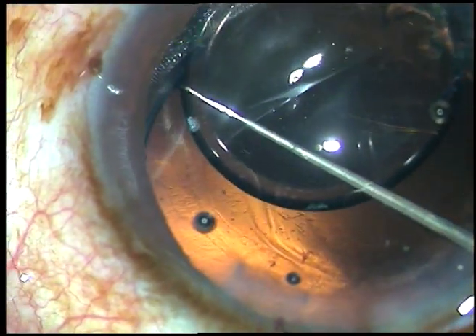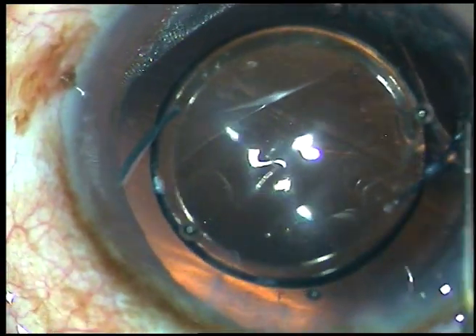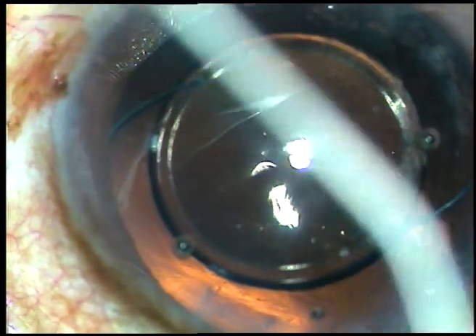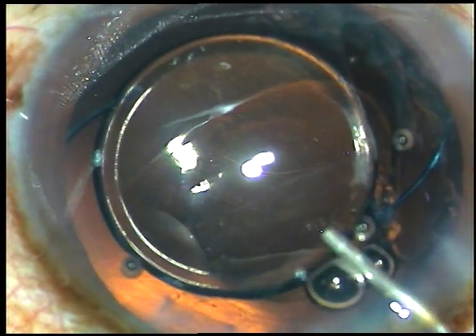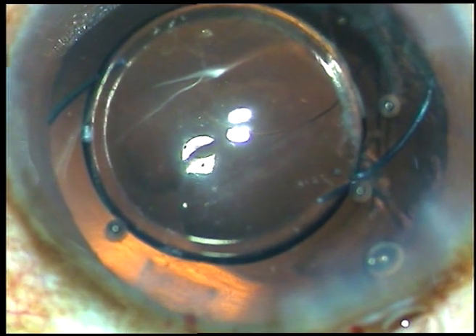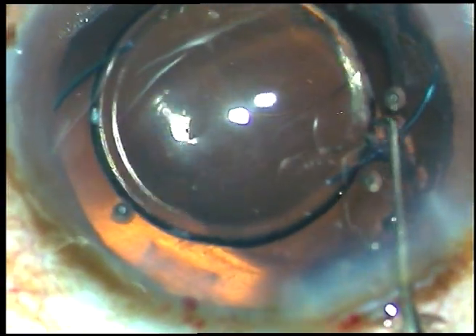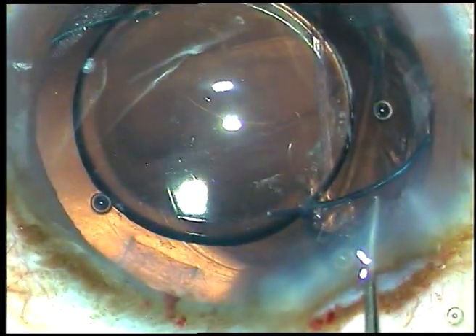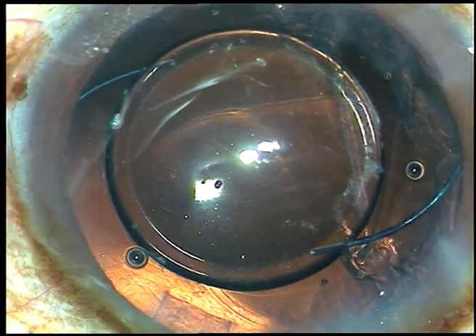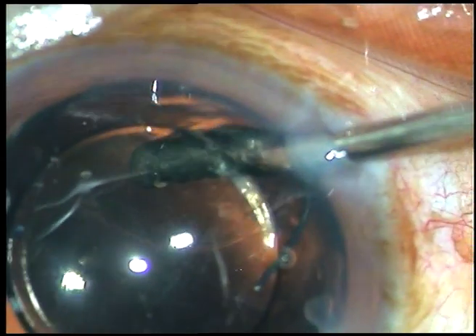Now the leading haptic has gone to the rent area. So I dial the lens and find that it is not coming easily from the rent area, and I had to exert some pull. Still part of the haptic is in the rent area — but now it has come out. I check and find that the lens is in the capsular bag, behind the anterior capsular rim. Now I do vitrectomy.